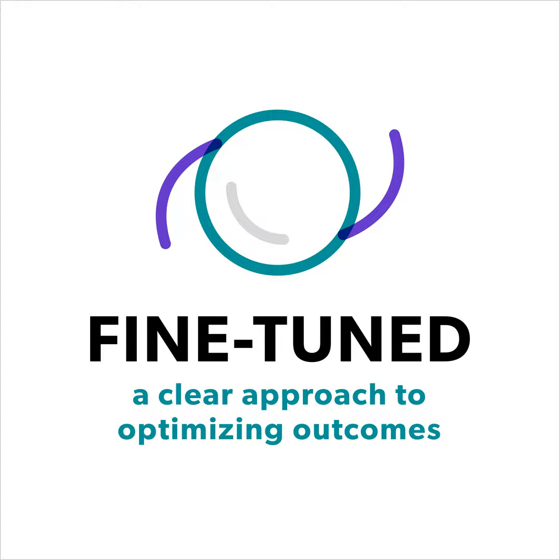So I know that on occasion you still perform wavefront optimized procedures. What would make you choose to perform a wavefront optimized procedure over an iDESIGN procedure? I use iDESIGN wavefront guided in the majority of my cases. I use topography guided in a small minority of cases. I rarely use wavefront optimized treatments. On occasion, I will use a wavefront optimized treatment when treating an eye with a multifocal or trifocal IOL that has residual refractive error after cataract surgery.